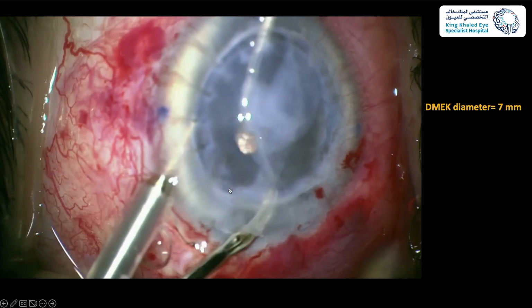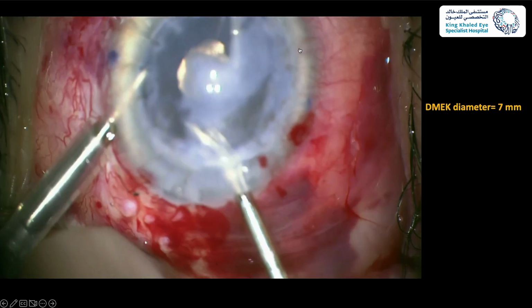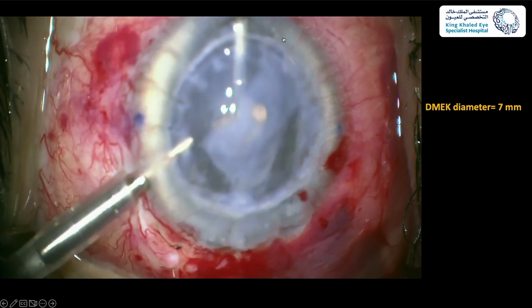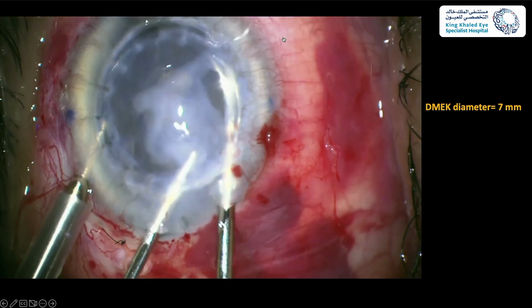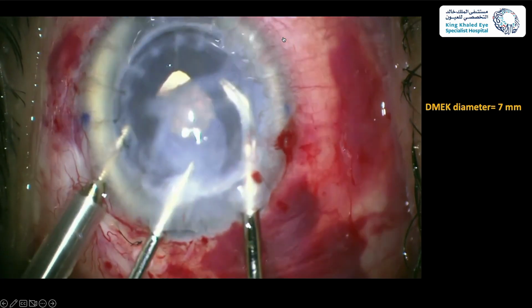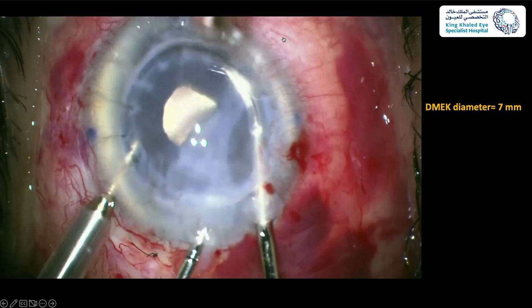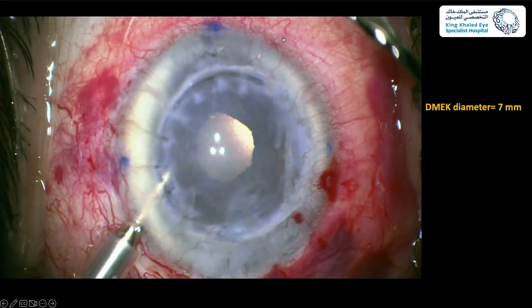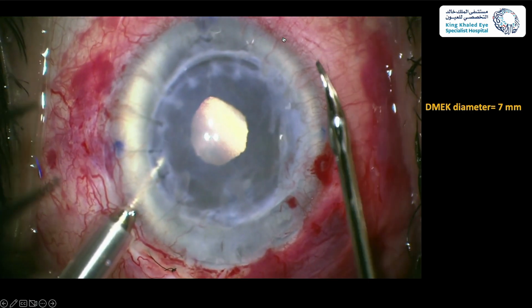So this area was hazy, so I guess the laser didn't cut very well through the area. So you still need your curved scissors, though you're using a femtosecond laser.